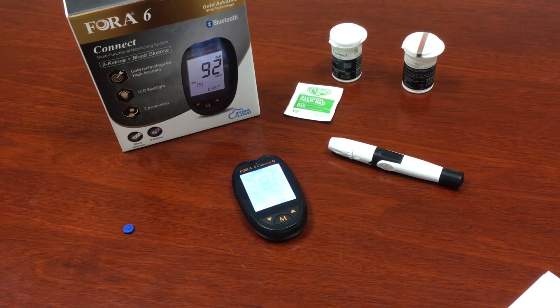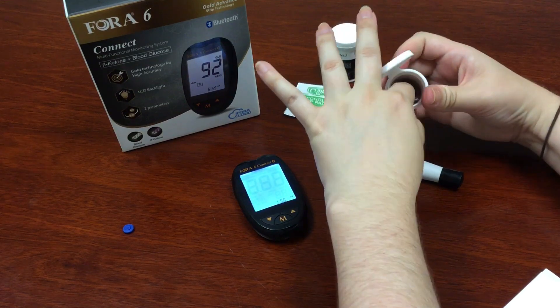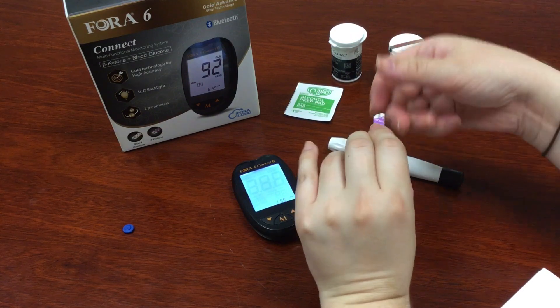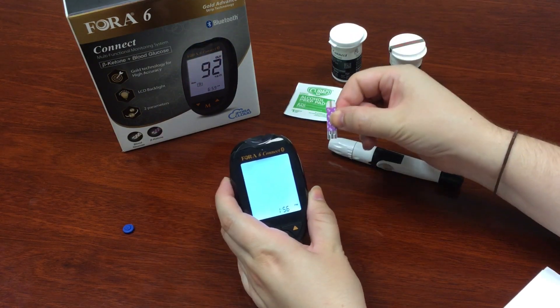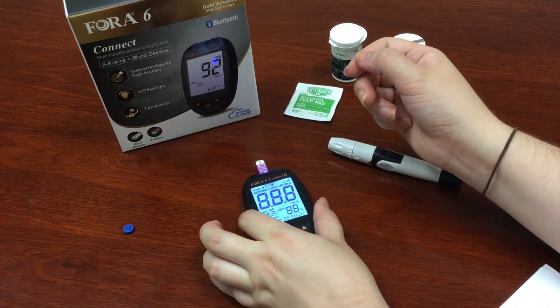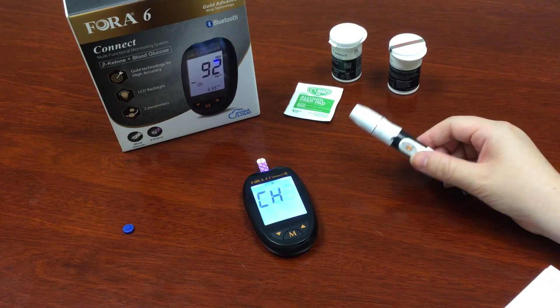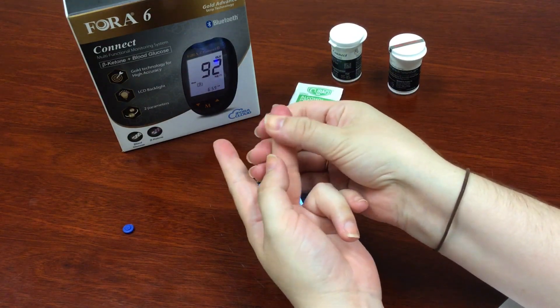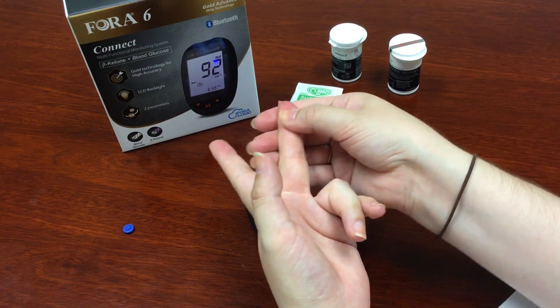Now we need to test ketone levels. Remove your ketone test strip from the bottle and close it up tight so no contaminants get in. This is the front of the test strip — insert it at the top and it'll turn your meter on. We've already reset our lancing device. Make sure to rub the side of the puncture again to get the blood flowing. Try to use a different finger or different spot so you're not sore from double punctures.